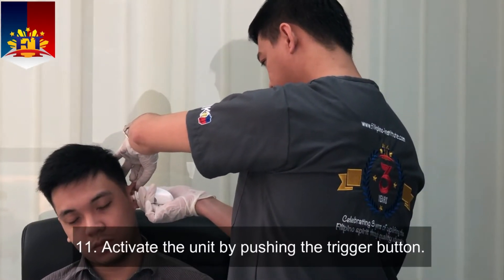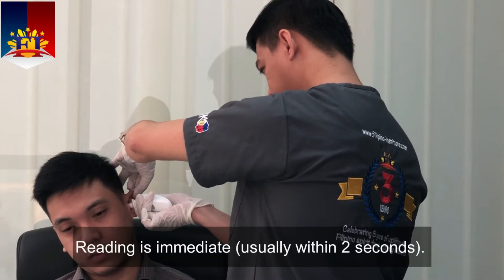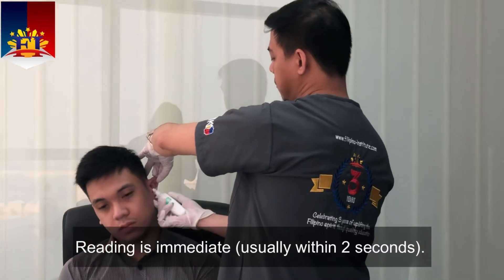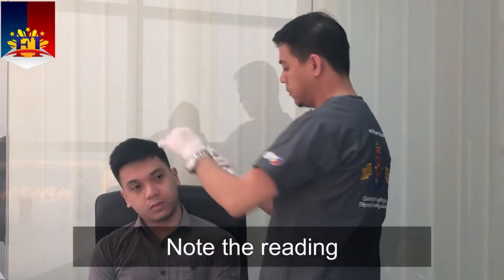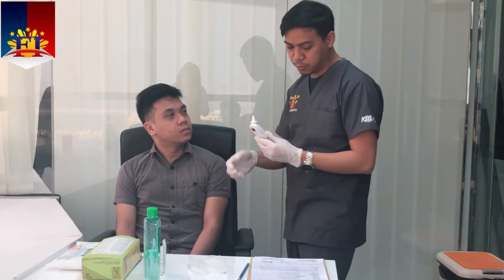Activate the unit by pushing the trigger button. The reading is immediate, usually within 2 seconds. Note the reading. Your temperature, sir, is 36.2 degrees, which is normal.